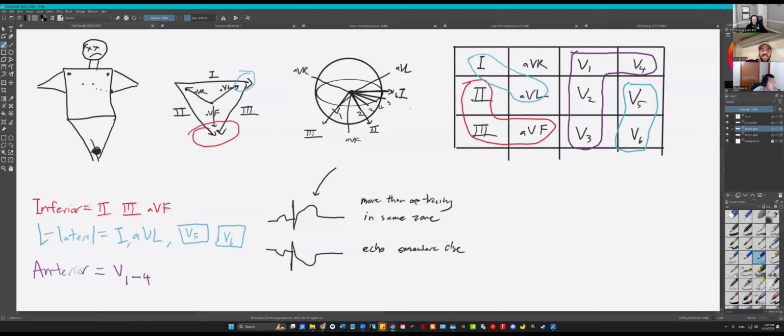So I had this guy. He looked like crap. He was diaphoretic and pale, and he had an ST elevation of like 2 millimeters in AVR, and everything was depressed. And I called the cardiologist. I'm like, okay, you're not gonna believe me, but this guy has a STEMI in AVR. He's like, yeah, yeah, yeah. I'm like, hear me out. He has a depression everywhere. Every lead has a depression, and he looks awful.